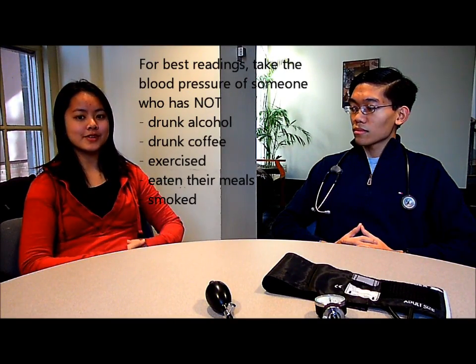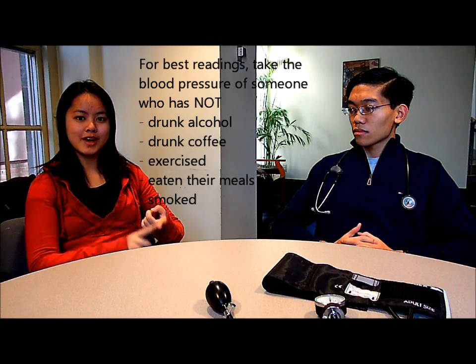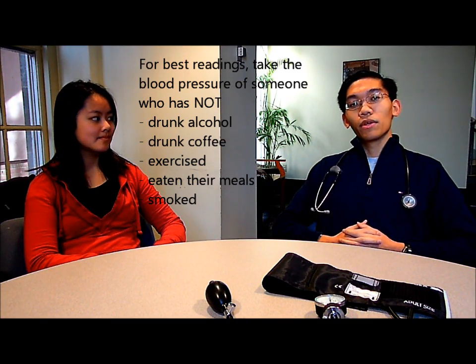For the most accurate readings, you should take the blood pressure of someone who has not drank alcohol or drank coffee or has done strenuous exercise before the reading. And also make sure that you screen the person's blood pressure before they've eaten their meal.